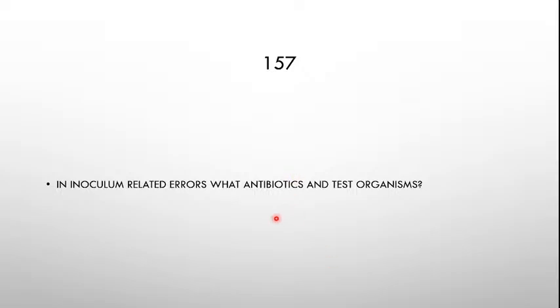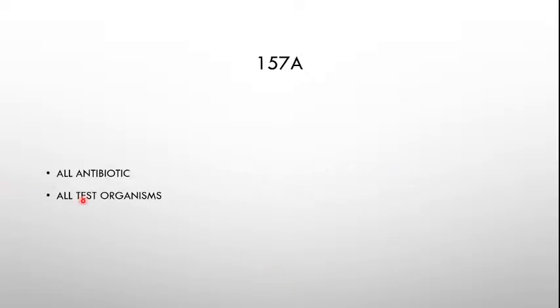Inoculum-related errors affects what test organisms? All. Bakit? Kapag sobrang kapal ng organism mo, sobrang thick ng bacterial suspension mo, okay? Sobrang resistant yung makikita mo. Kasi onti lang, mas madami yung concentration ng bacteria, di ba? So again, this results to commonsensical knowledge.